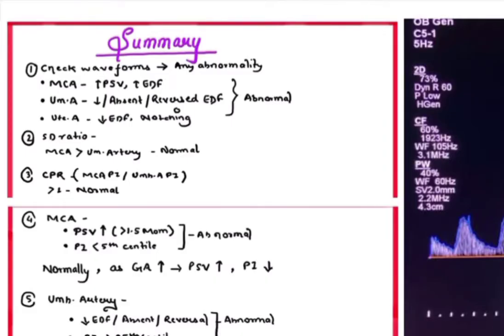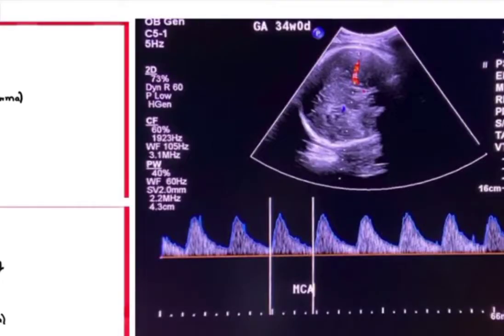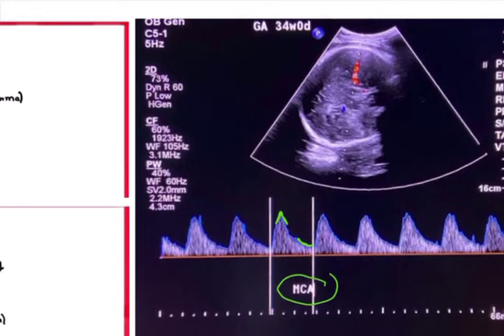The very first thing, once you get the OBS Doppler waveforms in your hand, is to check the waveform morphology — is there any abnormality? For the MCA Doppler pattern, you should look for the PSV (peak systolic velocity) and the end diastolic flow. Is there any raised PSV or raised end diastolic flow? Both of these things are abnormal.